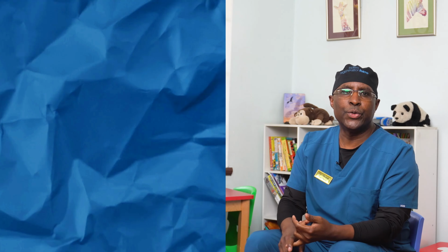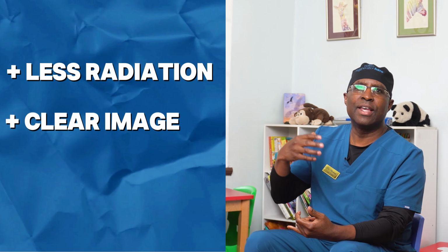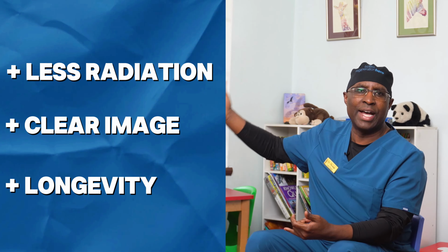Why digital? Because there is less radiation, and therefore you can take more x-rays. You are able to see the picture or the x-ray very clearly on a computer screen, and you're able to store that on a long term. The ones which were manual on the film, they degrade with time, and therefore you can't refer to them a year, 2 years. But now with the digital x-rays, we're able to see that.